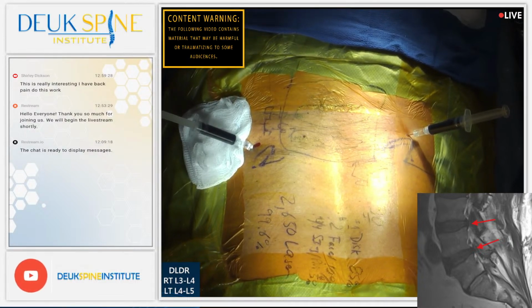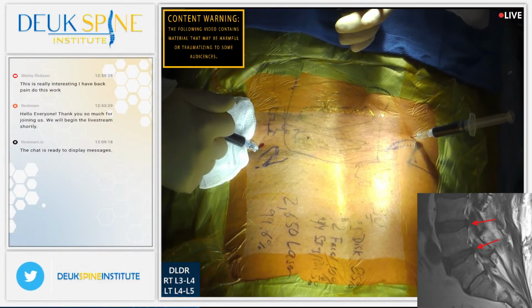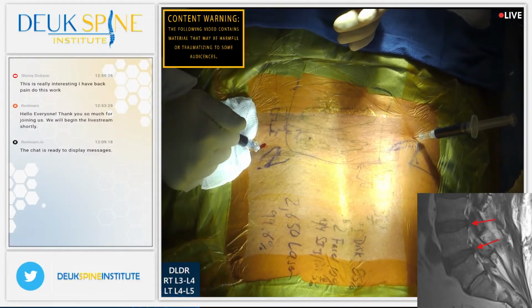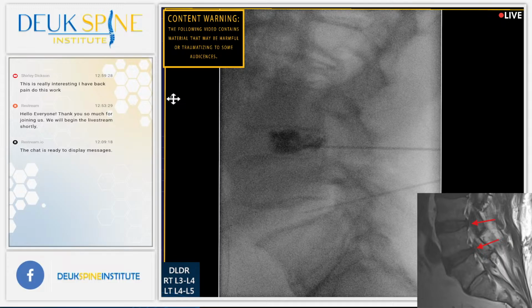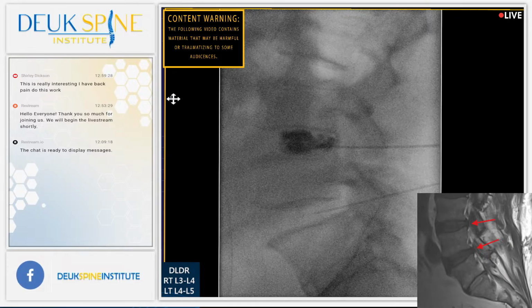No. All right. He's comfortable not having any pain. How bad is that on a scale of 1 to 10? How high did it go? What number? 8? I heard 8. All right. Is that where you get pain? Yes. He said, yeah. 8 out of 10, concordant.